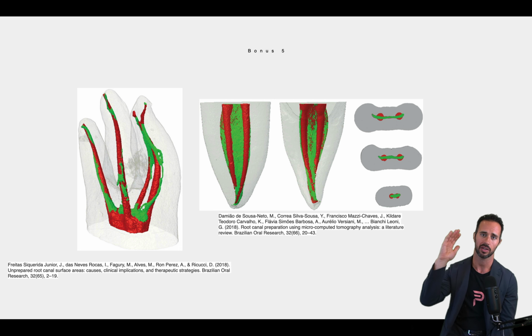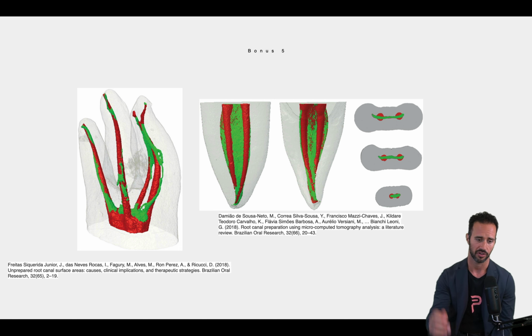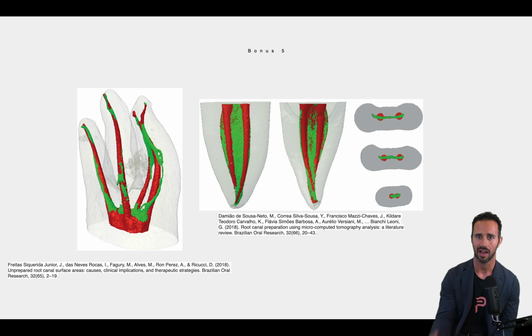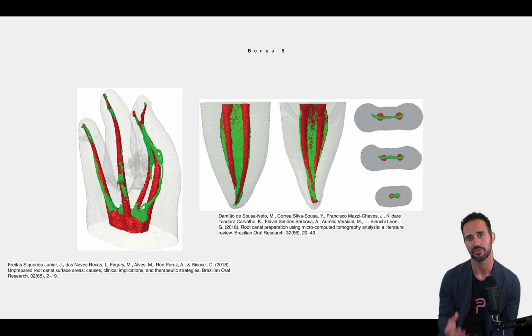Whereas root canal treatment used to be a 3-hour procedure with your tedious step-backs with hand files, imagine all that time sodium hypochlorite was allowed to soak inside the tooth leading up to your eventual obturation.